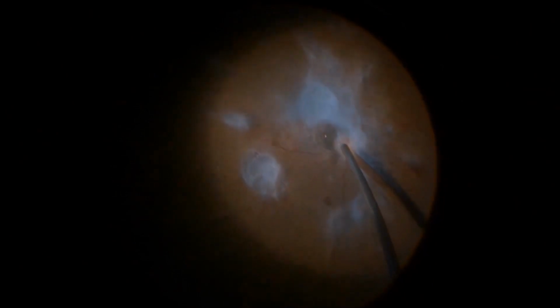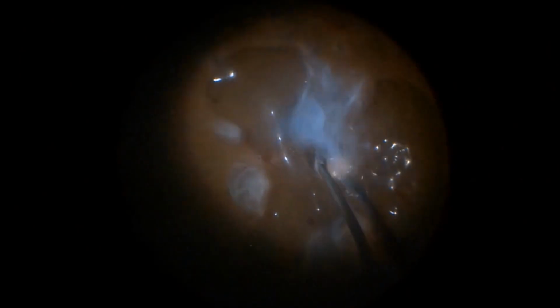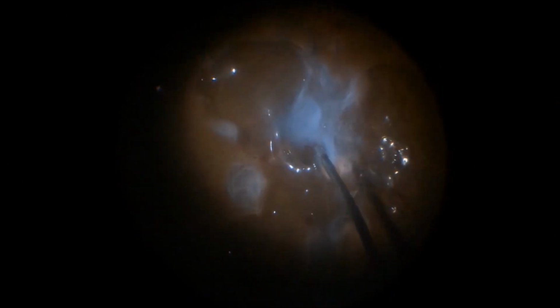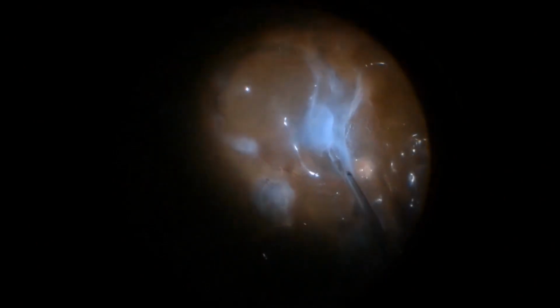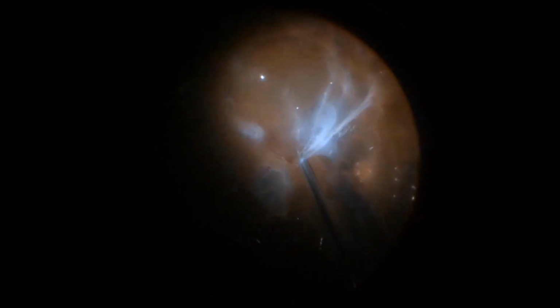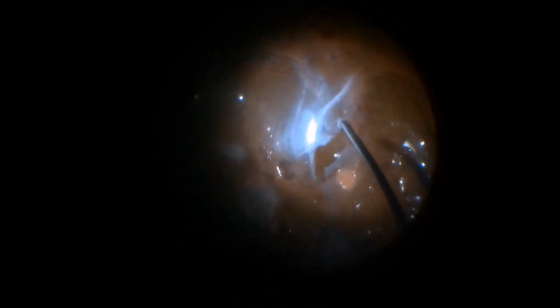Once the plane is created, PFCL is injected between the thick hyaloid face and the retina. The PFCL gradually separates the hyaloid from the underlying retina. It helps in membrane dissection. So PFCL not only supports the underlying retina, but it also pressure tamponades the bleeders. This is followed by further dissection with the help of a cutter only.